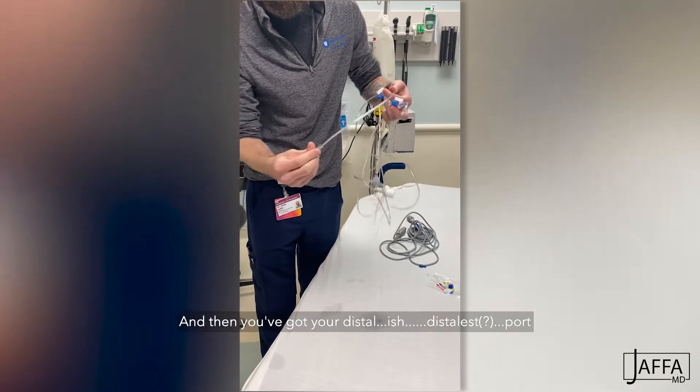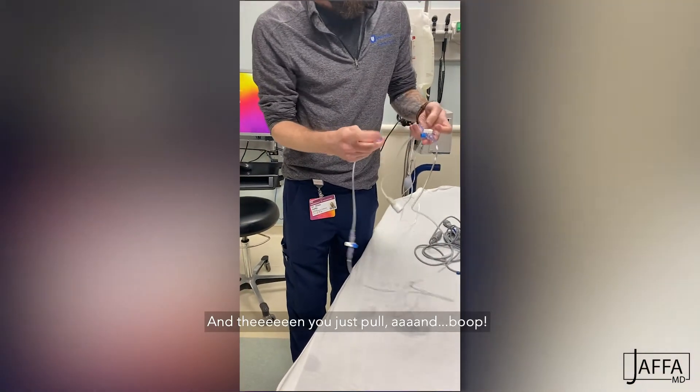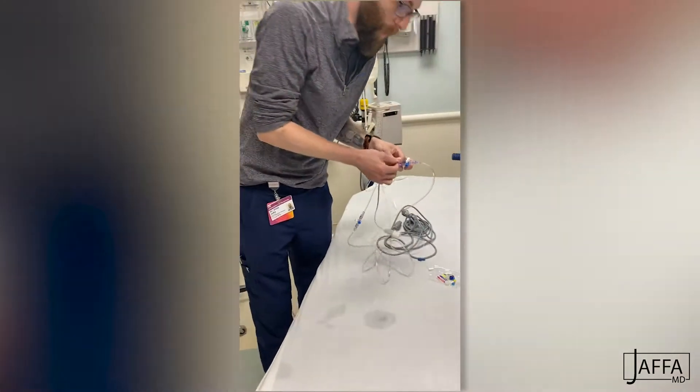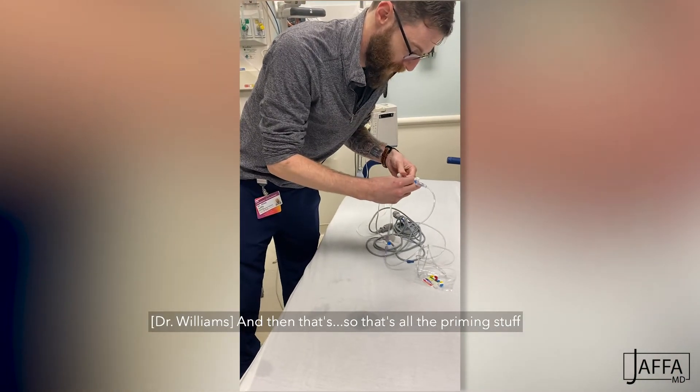And then you've got your distal-most port. You just pull and then you're done. So you can just recap it with this thing for the moment. That's all the priming stuff.